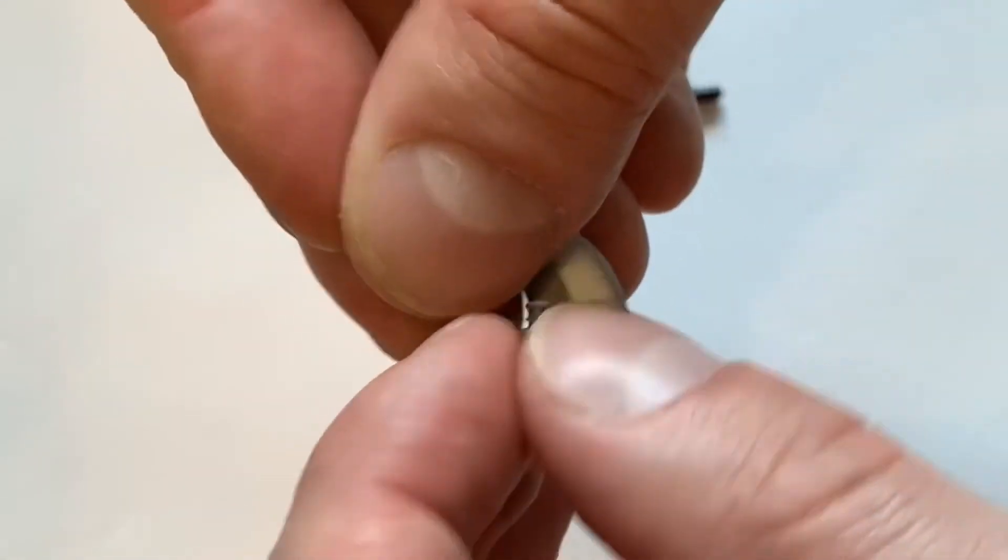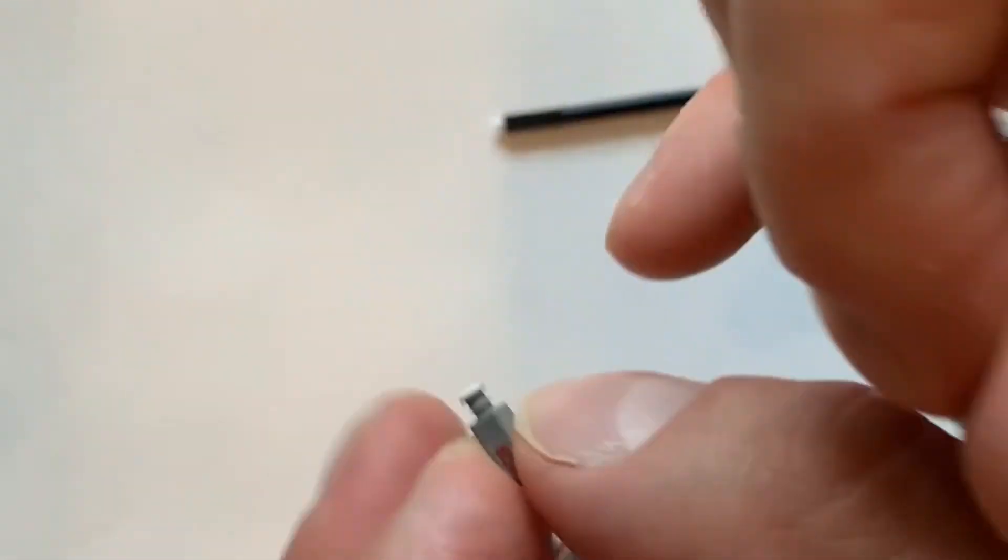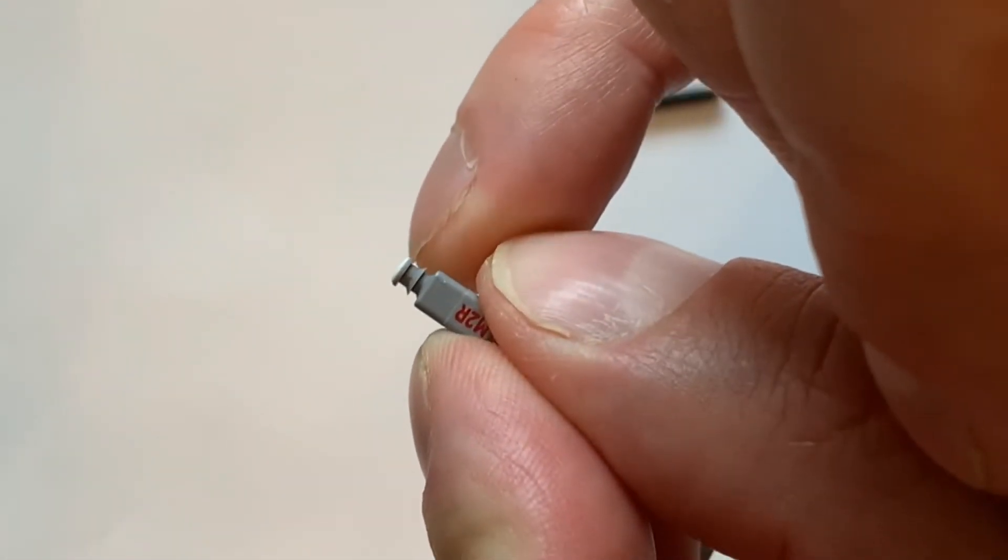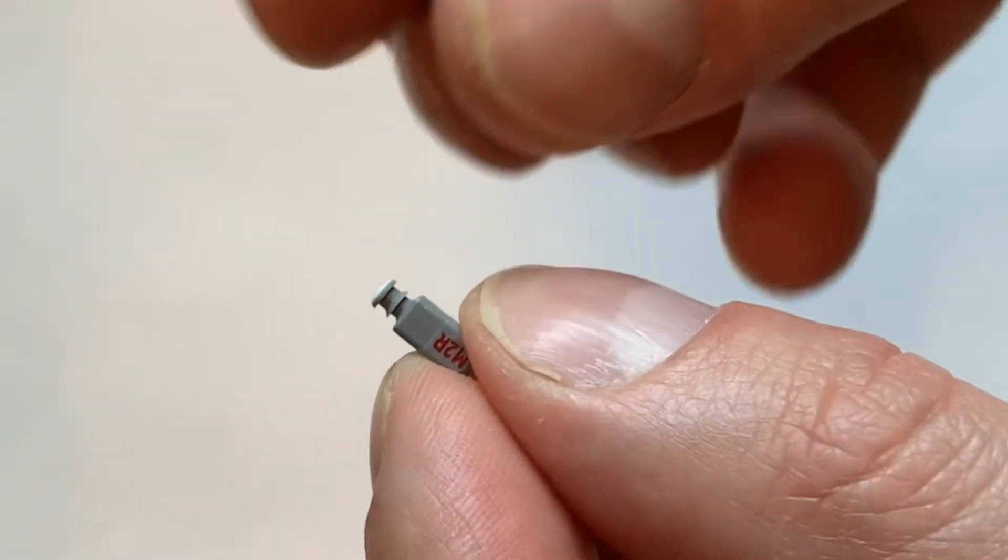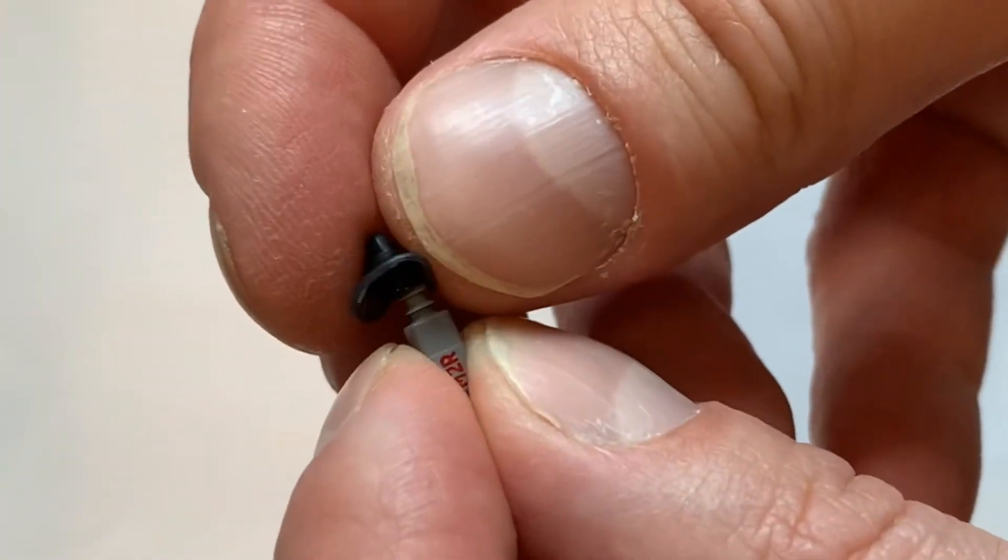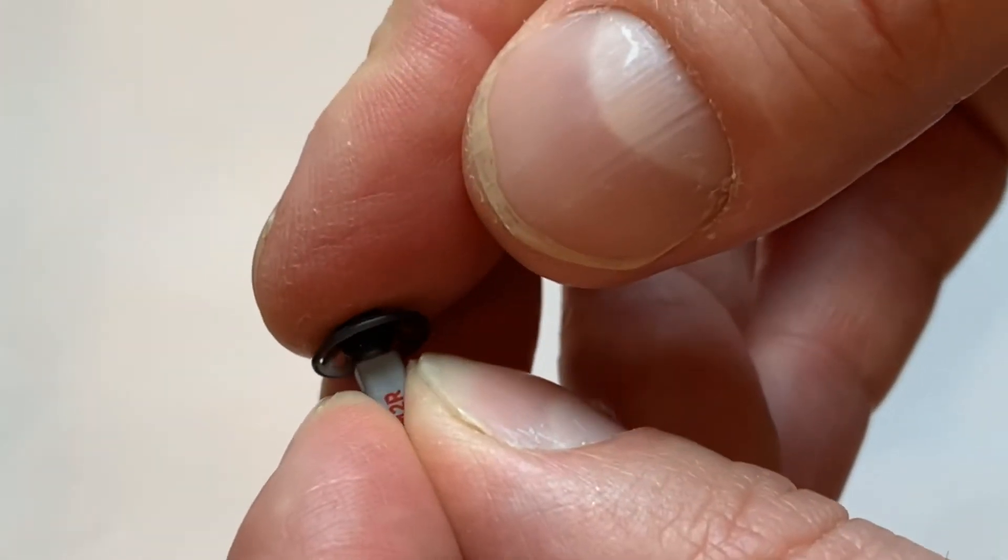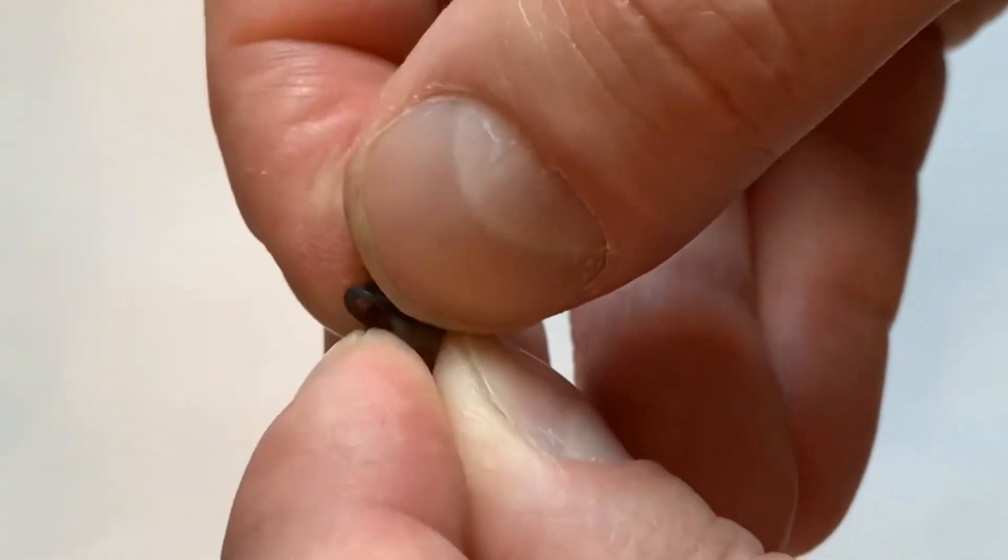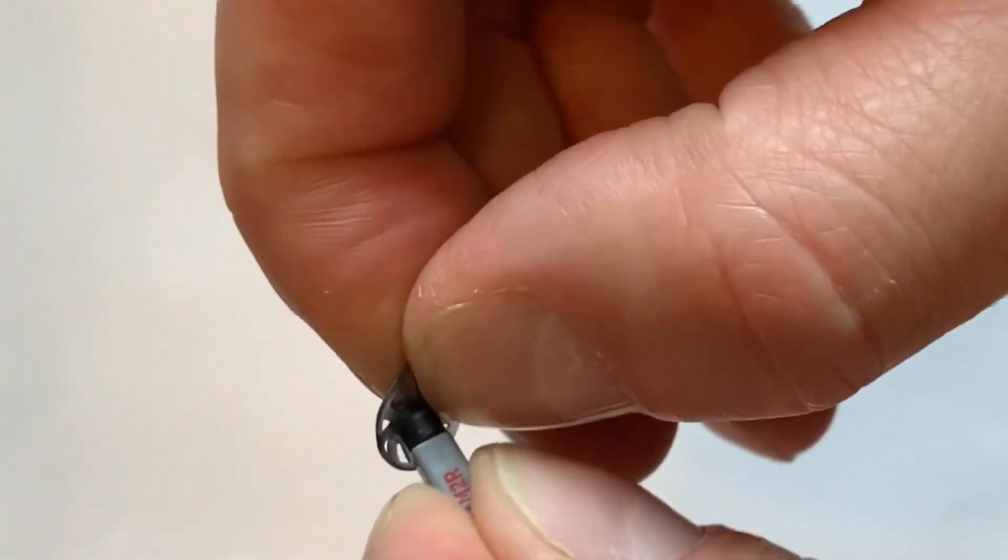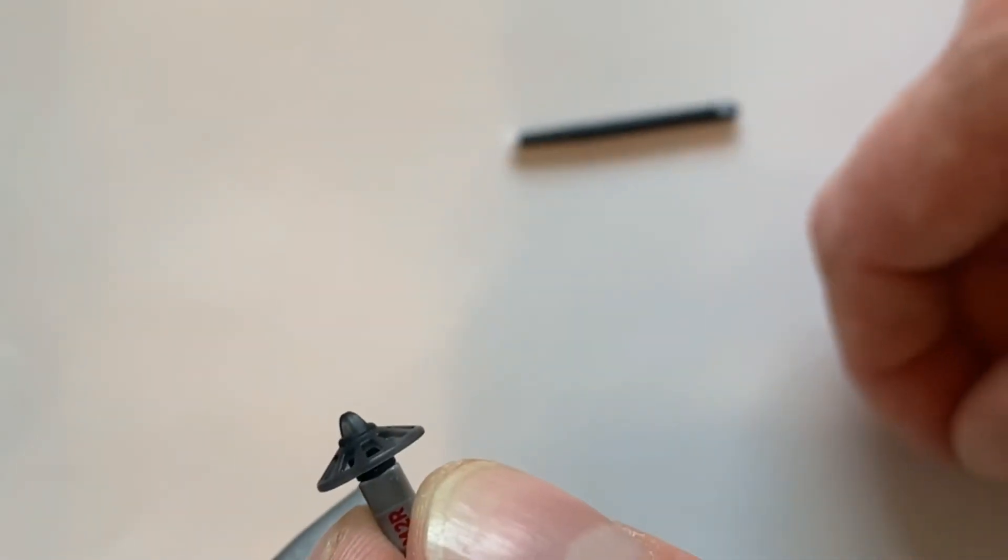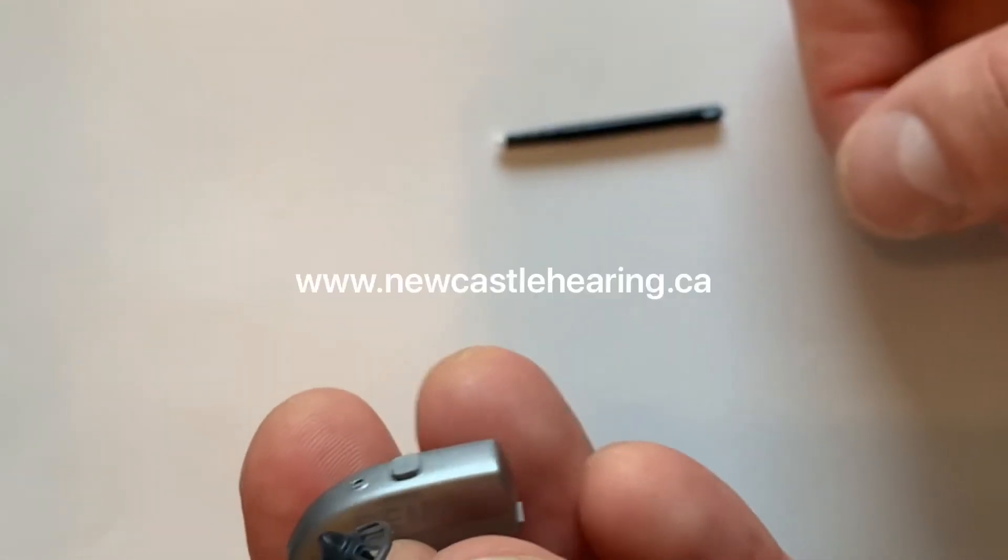And when you're putting it back onto the end, I want you to watch. Look carefully. There are two ribs sitting there. It's important when you replace the dome that you slide it over top of both of those ribs so that it's held on nice and secure. Give a little bit of a tug to make sure that it's in place. And now you should be good to go.